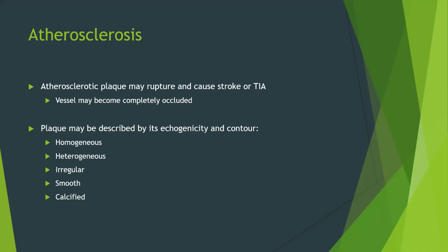I had stroke-like symptoms. Ask, how long do the stroke-like symptoms last? Is it still going on? One thing that can happen as well is that the vessel may be completely occluded when it comes to atherosclerotic disease. Okay, so we'll talk about what the criteria is to say whether or not it's occluded and what percentage of stenosis.